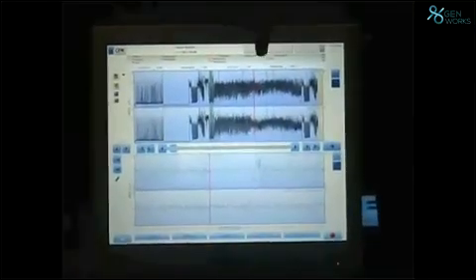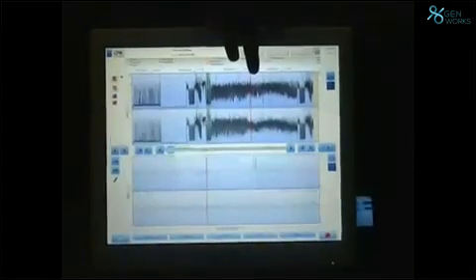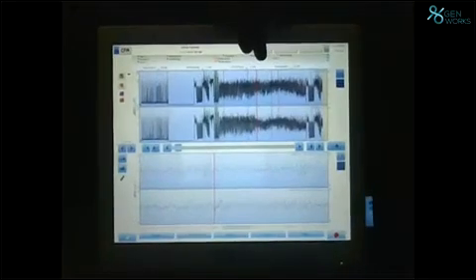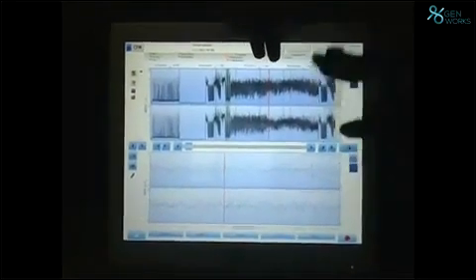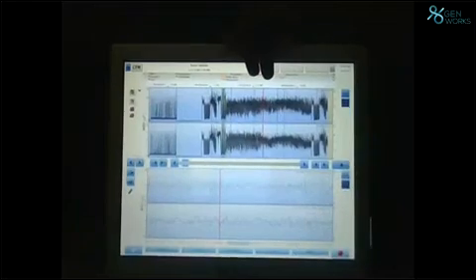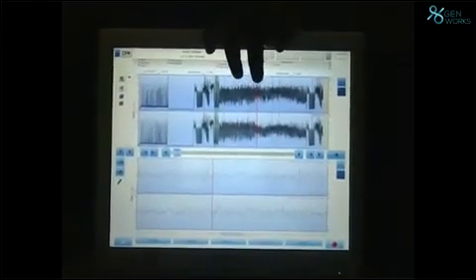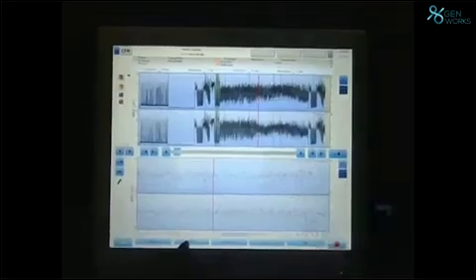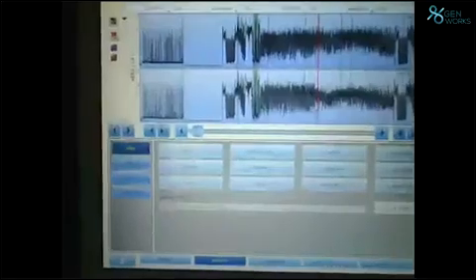Okay, see now, can you people see my finger here? I have put a red line. That means the system might have seen some problem where the lower margin is rising or coming very down. That's what they used to see in previous times. Now, after pressing here, she has to do the marker. See, can you people see? Please, can you come near, sir?